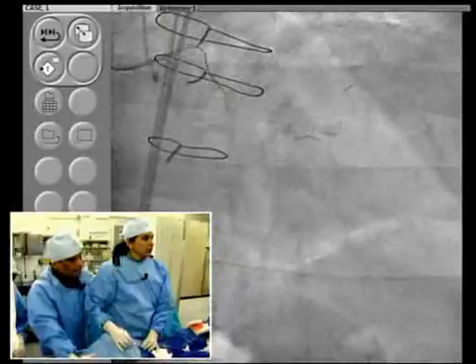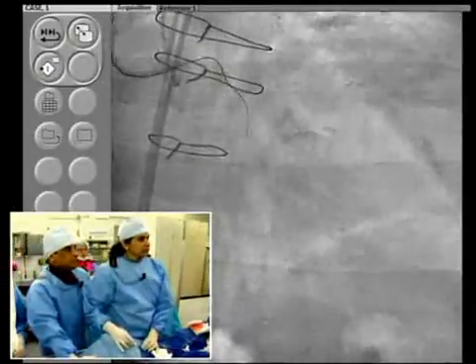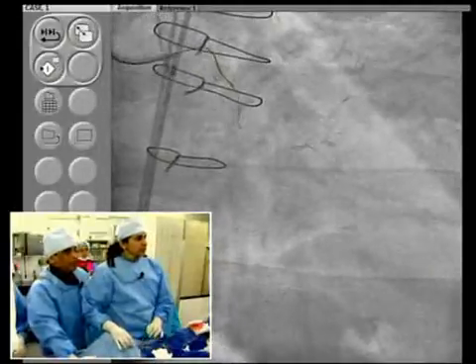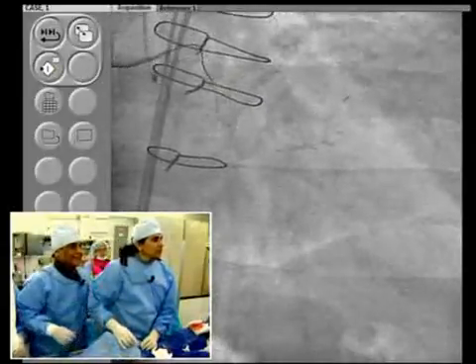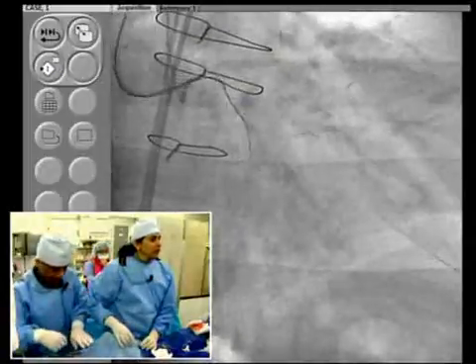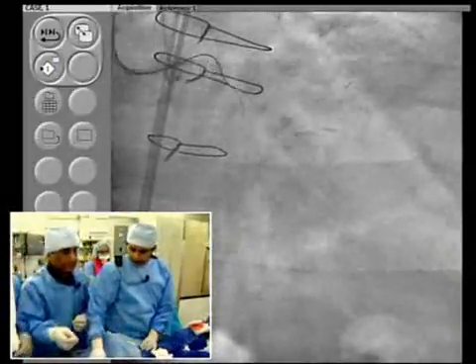Well, nothing compares with such incredible results. 5,900 PCI, nobody goes to surgery. That's a much more powerful statement than any editorial or rebuttal. This is just impressive data. Anu, what is your strategy here? No, I think we have pulled back everything to have a different entry all the way.